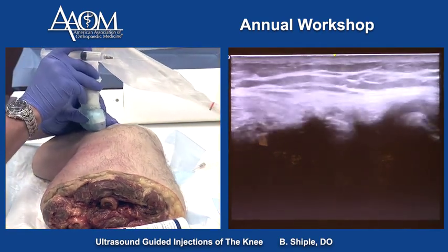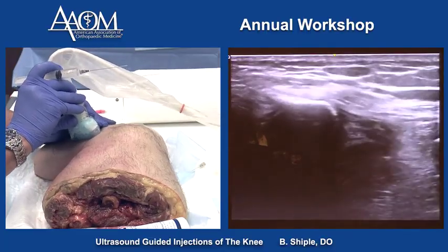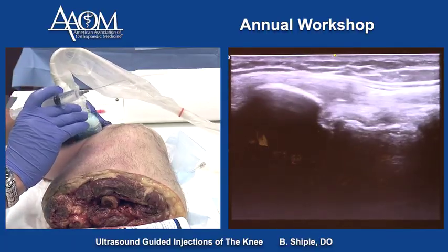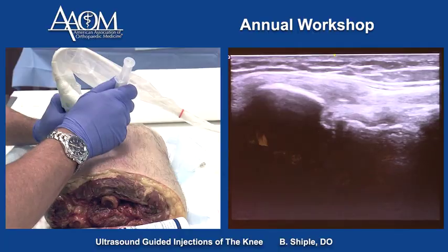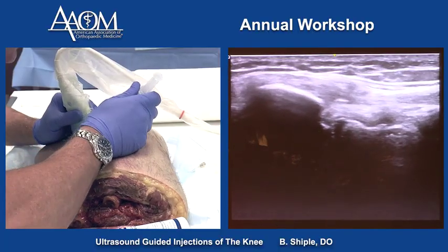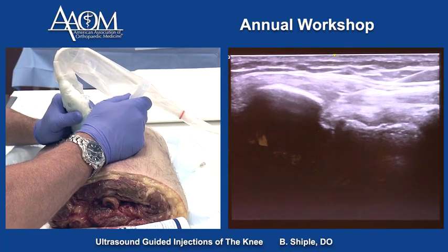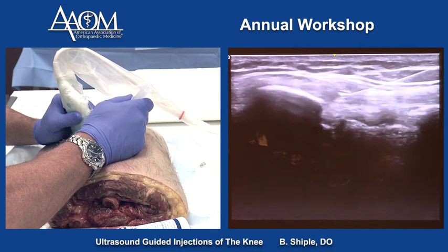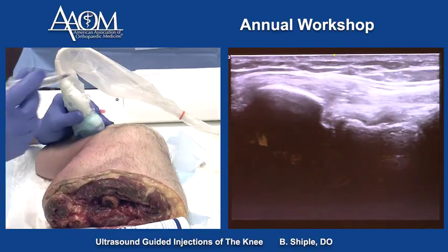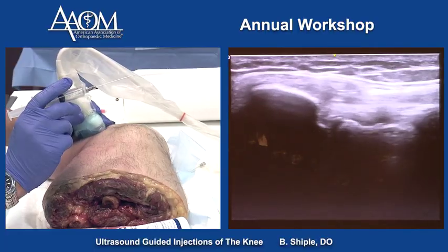We can also show you the long axis technique for getting the needle into the lateral collateral ligament. This is a backhand technique and more advanced, but we are going long axis under the probe, and the needle is in the insertion of the LCL onto the fibular head right there.